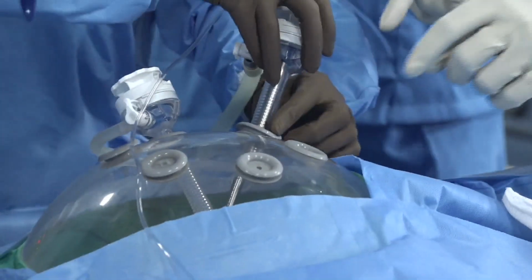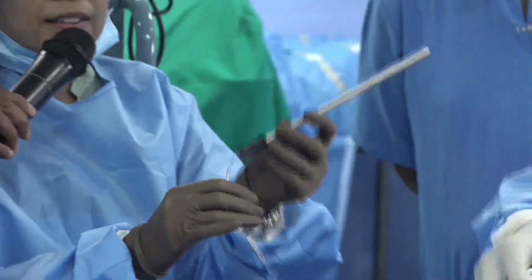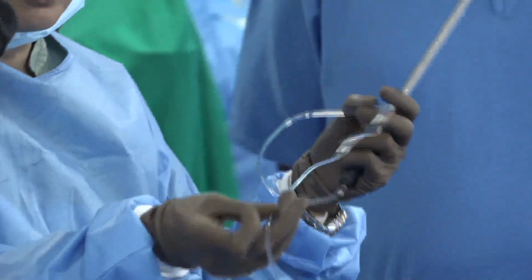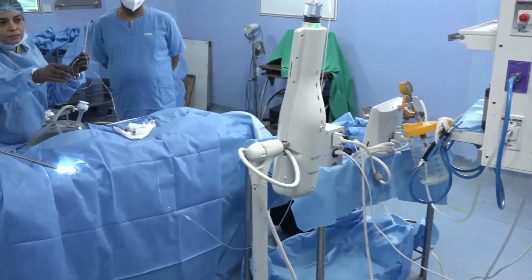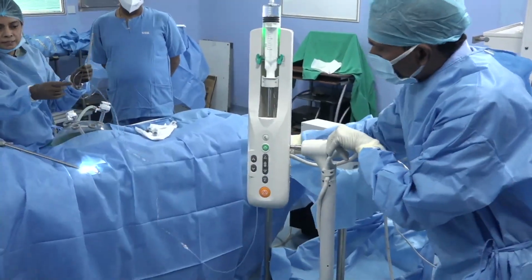Okay. So we go again. As for this capno pen, as you can see, this is connected through a Luer lock mechanism into this injector system. Now please focus on the injector system. Can you come there? Turn it so that we can see. Just roll it. Please focus on the injector system.